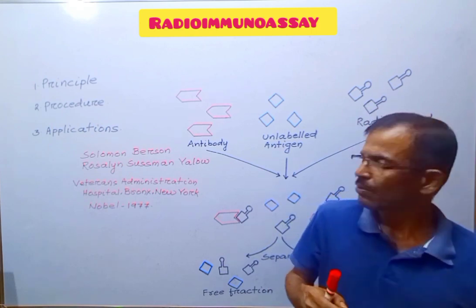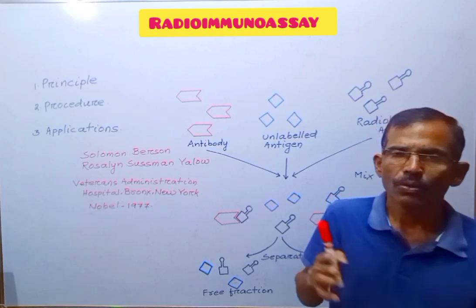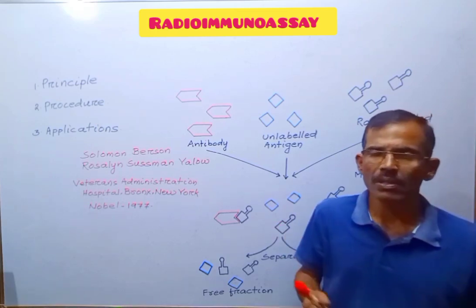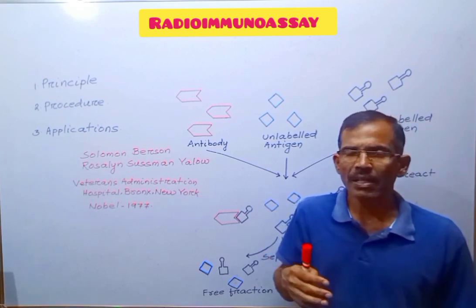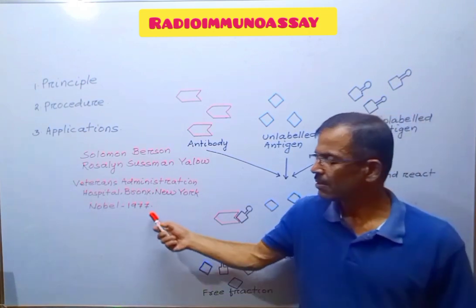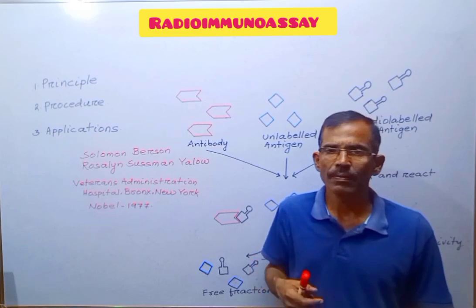This technique was developed by Solomon Berson and Rosalyn Sussman Yalow at Veterans Administration Hospital, Bronx in New York. For this technique, Yalow received the Nobel Prize for Medicine in 1977 along with two other scientists.